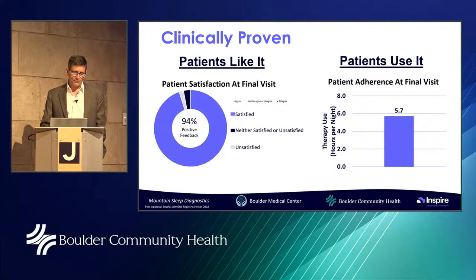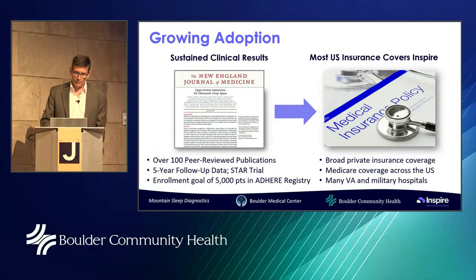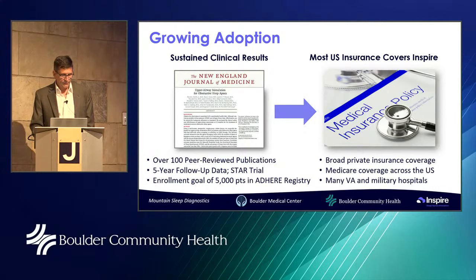And you look at people in terms of their use of it, they'll tend to stick to it about 6 hours a night. I wish I always got 6 hours of sleep a night, but that's how long they're leaving the device on and keeping that therapy going. The other thing we find is over time it works out, and even if you took somebody and turned their device off and put them back in a sleep lab, you know what, they'd still have sleep apnea. So it's not like it fixes the sleep apnea and you can turn it off. You keep it rolling and it keeps working over years and years. This 5-year follow-up data is actually probably out to about 7 or 8 at this point.